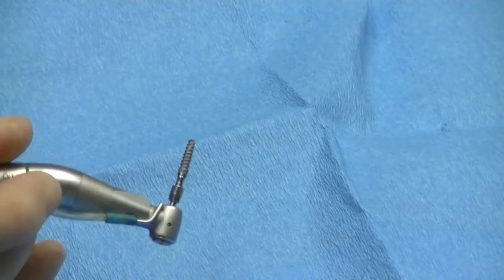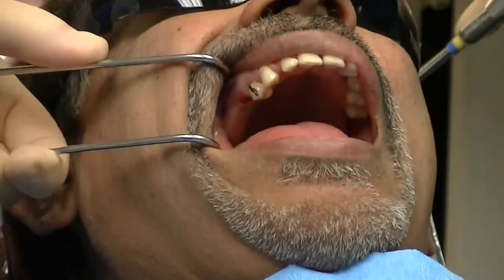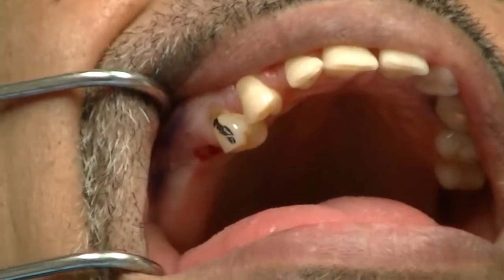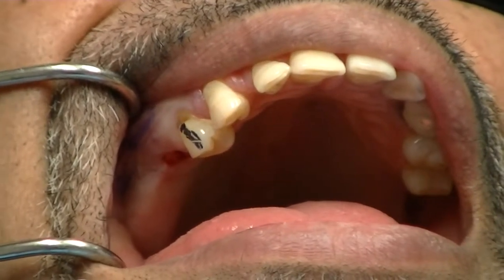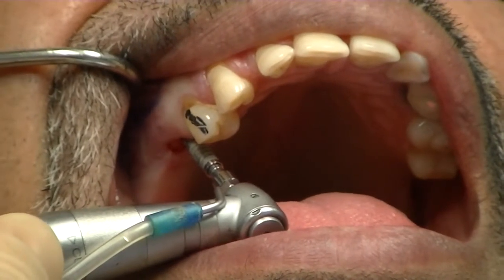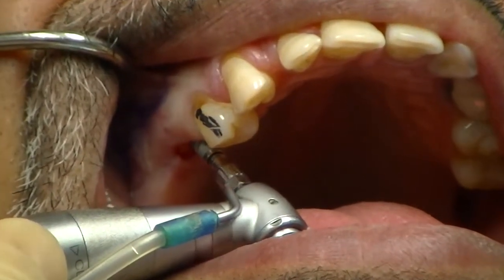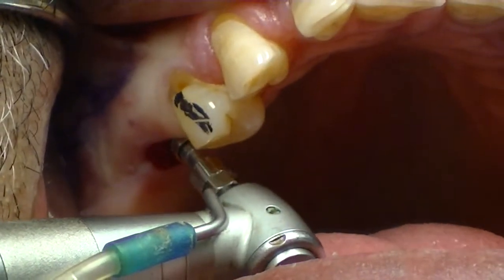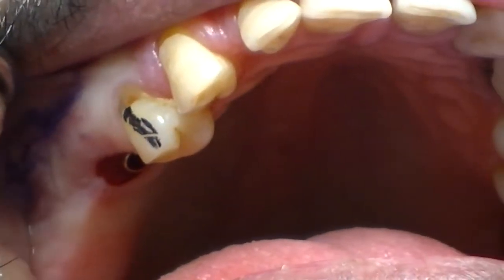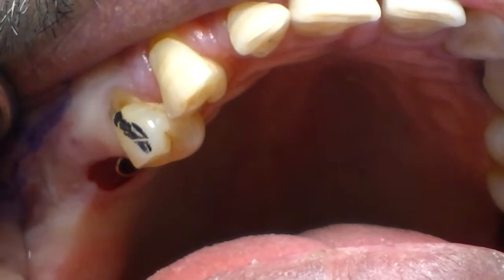It's imperative to always test your speed setting — confirm it's rotating very, very slowly. The surgical site has very little bleeding; we have complete control. Even patients on moderate blood thinners aren't a major issue. Going to the site and running the handpiece, I'm not placing this implant all the way in — I'll stop at soft tissue level. Remember, we said soft tissue was about 2mm.